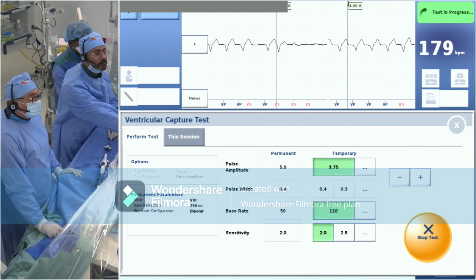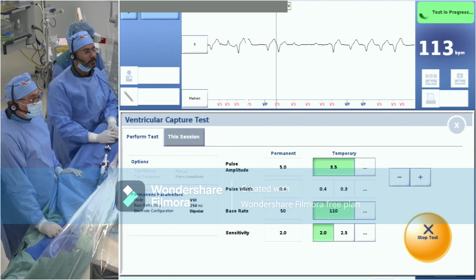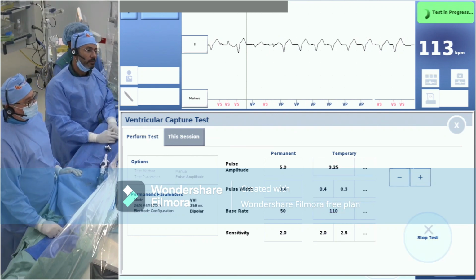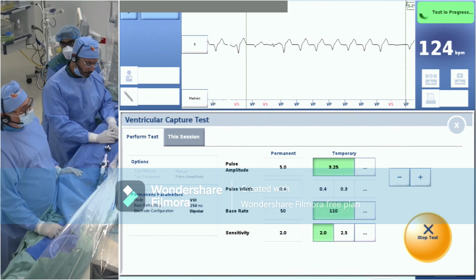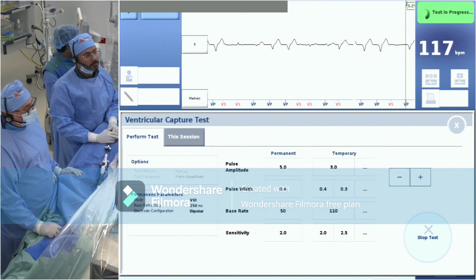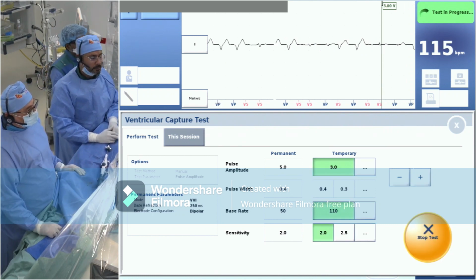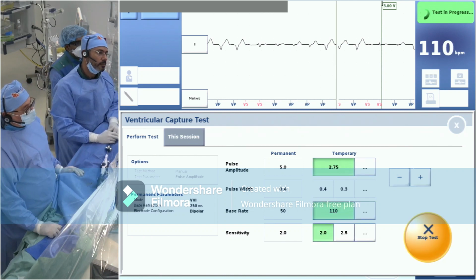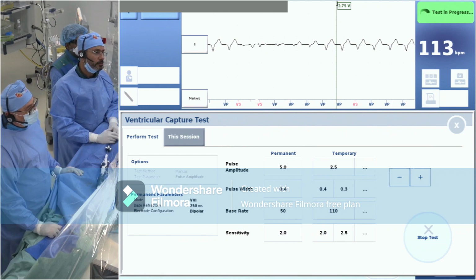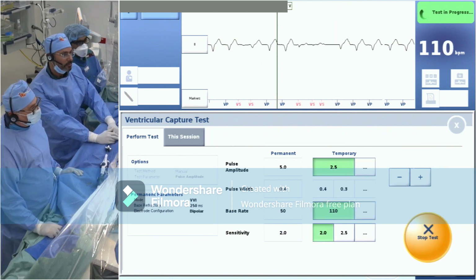Dr. Mohamed, I'm wondering whether there is a risk of iatrogenic PVC creation because of the movement of the device. Is it possible, the first one? The second one is, do you have any experience of implanting these devices when there is already a malfunctioned lead inside? Do you go for extraction first and then leadless pacemaker, or do you ignore it and go directly for leadless in case of malfunctioned leads inside?